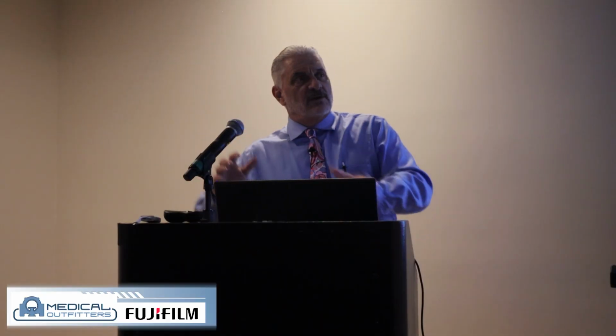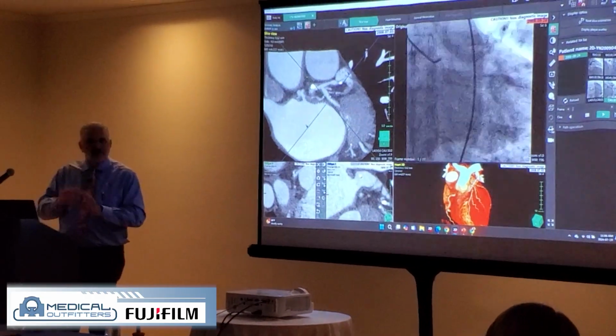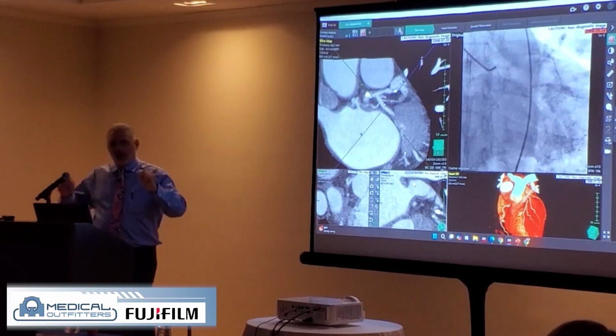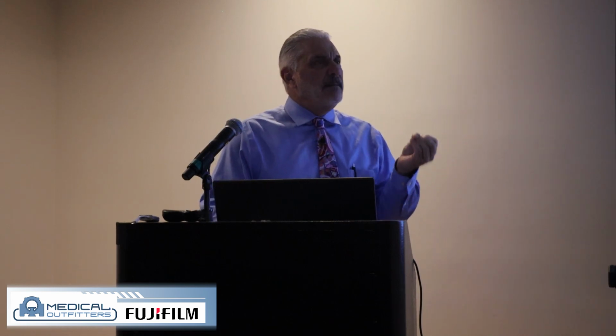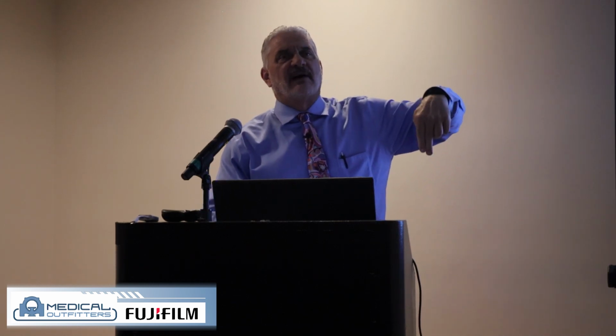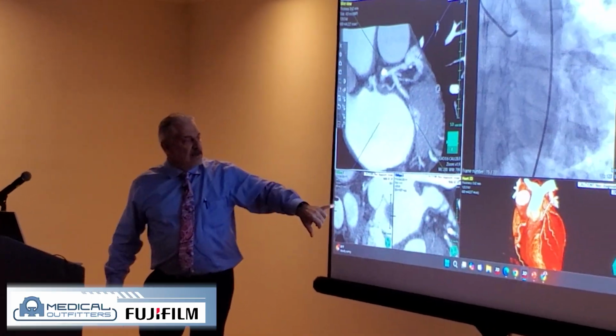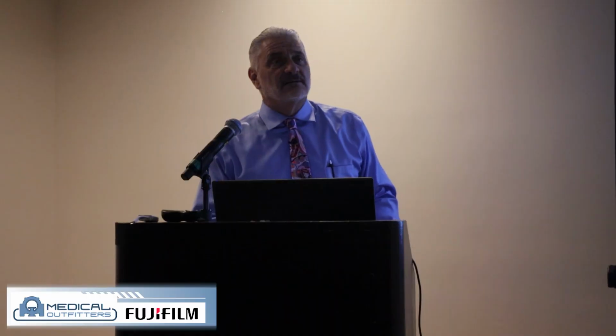And for those of you that go a little further back in the history of imaging cardiac CT, there was a physician, his name was Stefan Achenbach, and he was from Siemens. I worked with him in Germany for a while, and he was one of the first ones that didn't want all the bells and whistles: straightening vessels out, curved planar formats, multi-planar reconstructions. He really liked the fact that he could use an MPR or a thickened MPR to roll and follow the barrel of the vessel. Using the thickened view and the other two views, this guides him to the parallel and the perpendicular view as he goes down.